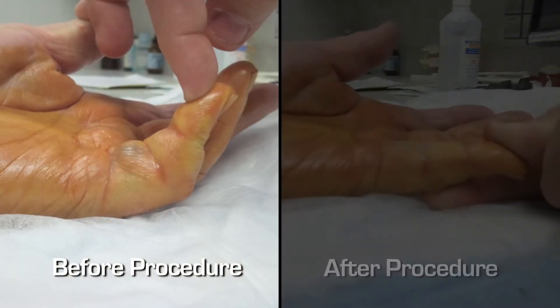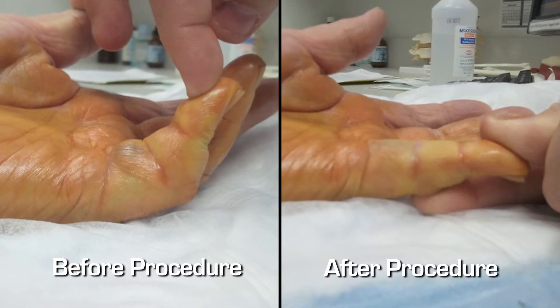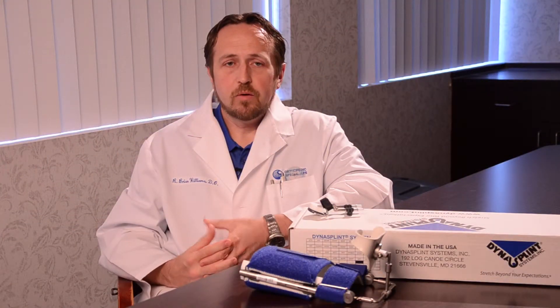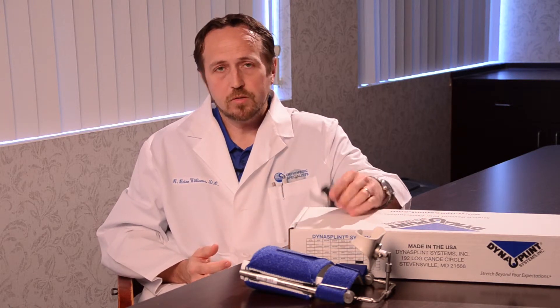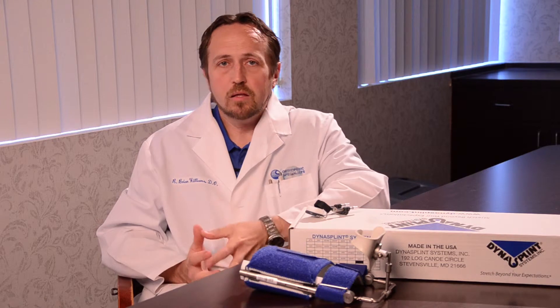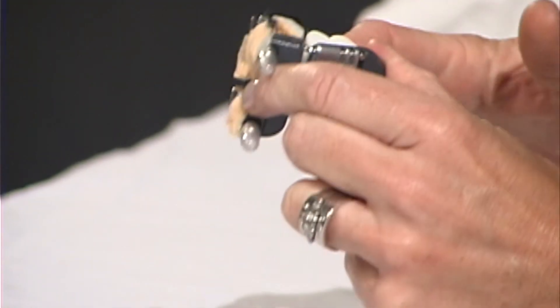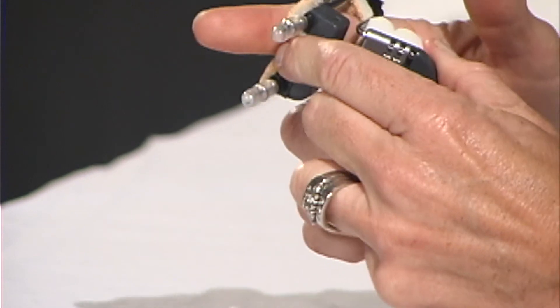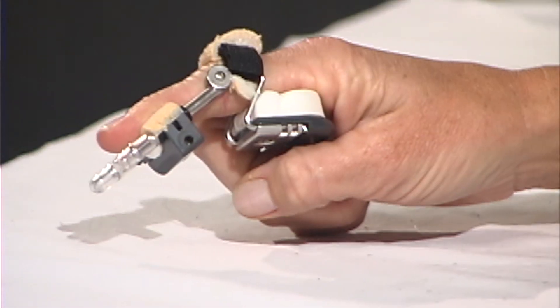Once we perform the manipulation and actually break that band of tissue that's causing the contraction, I have found it particularly beneficial to use the Dynasplint finger splint to try and maintain the extension of the digit. The natural tendency of the digit is to return into the flexed posture that it started with before we did the injection, and with Xiaflex we're not removing this tissue — all we're doing is breaking it.